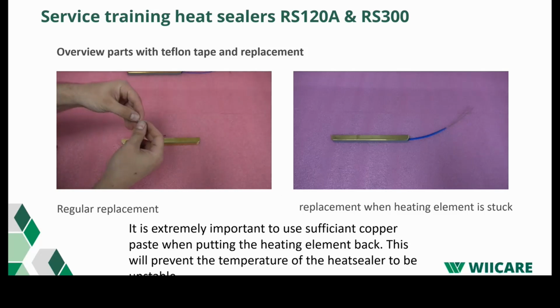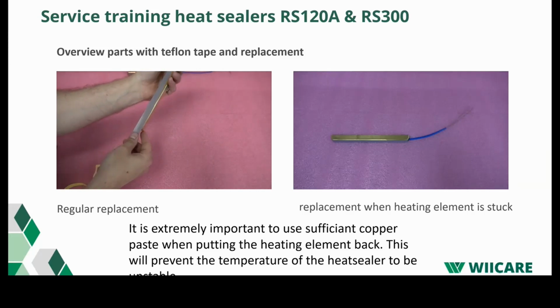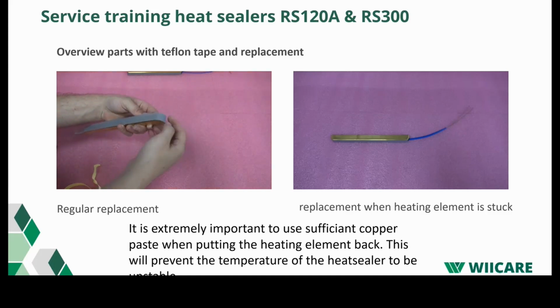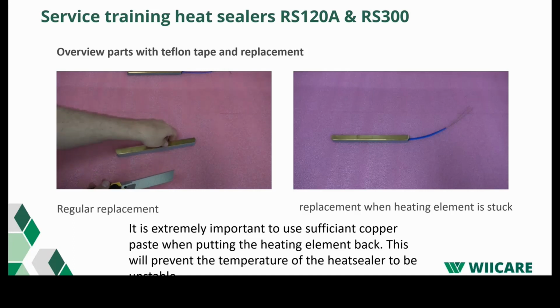Apply the new tape. Don't pull on the tape, just gently push it around the corner. Now cut off the excess. It is very important to use a sharp knife.